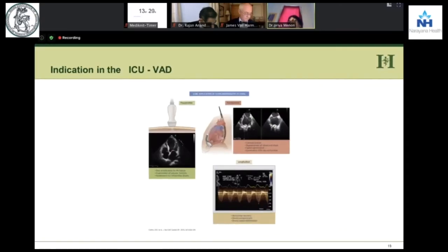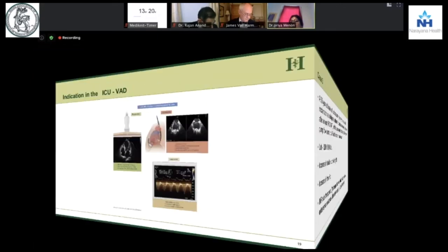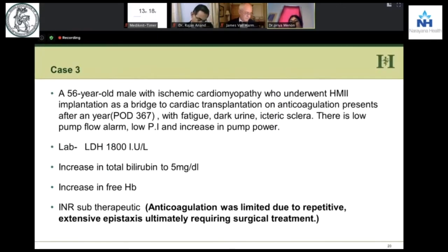These days we have VADs — the previous speakers have already spoken about them. Let's see how the VAD behaves in the ICU. Here is a 56-year-old who had a HeartMate 2 as a bridge to cardiac transplantation, done almost a year back. In between, he had some bleeding from the nose, so his anticoagulation was tapered. Now, suddenly he comes in with fatigue, dark urine, and icteric sclerae — totally yellow.